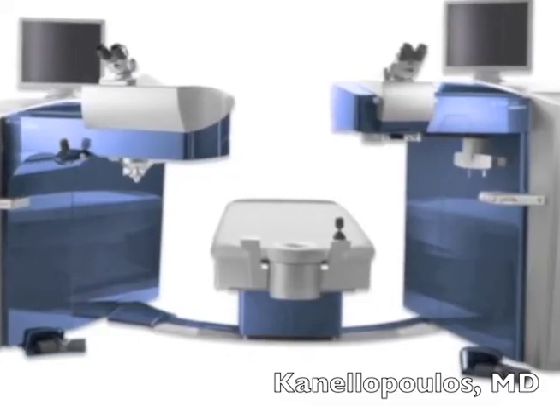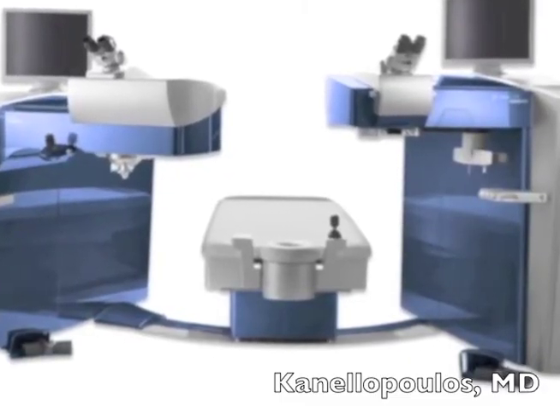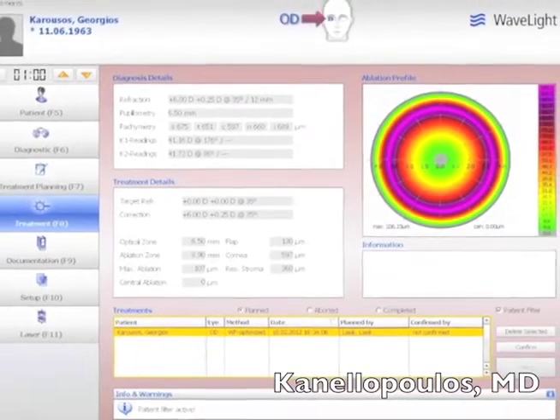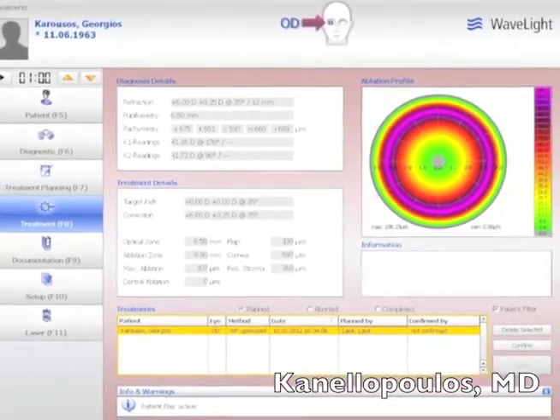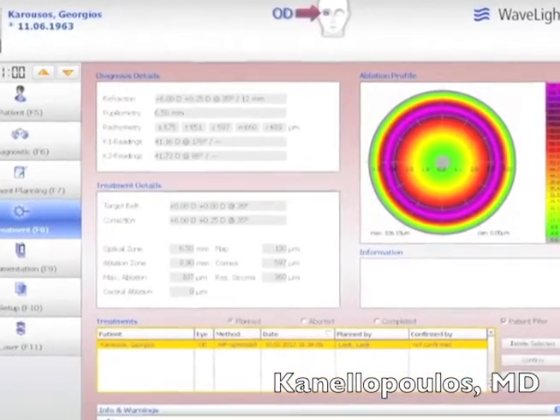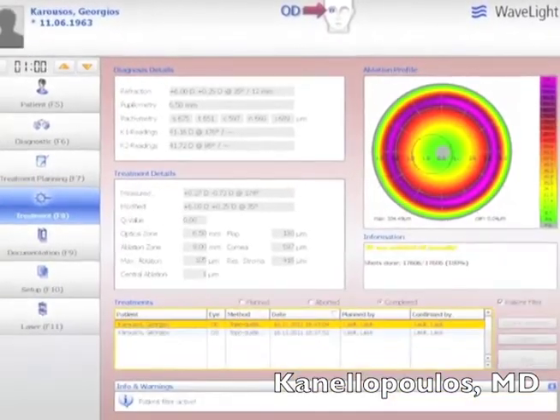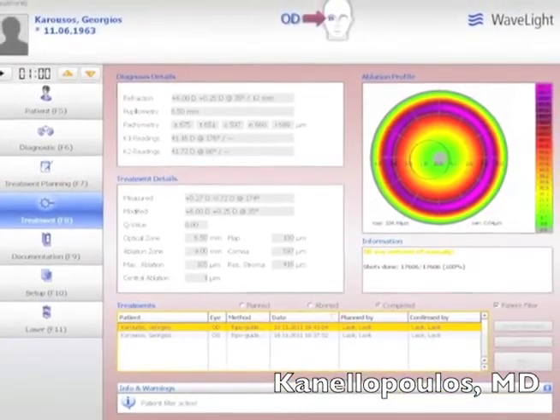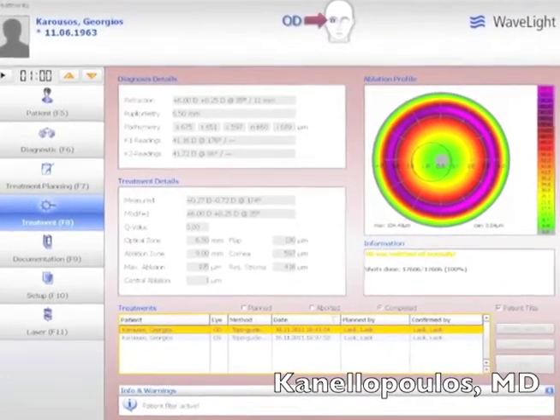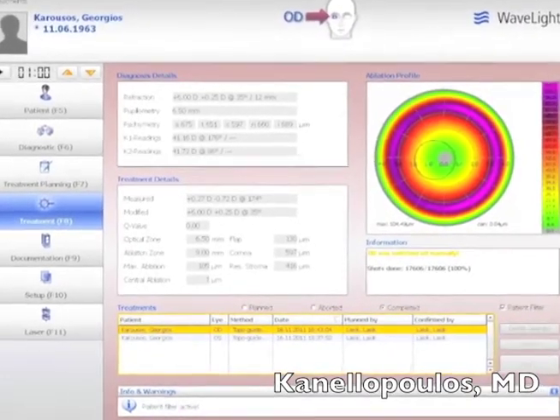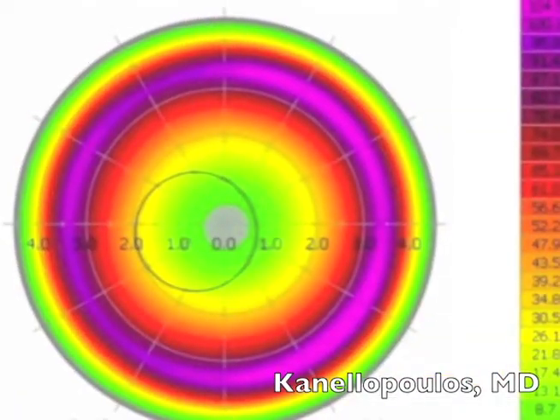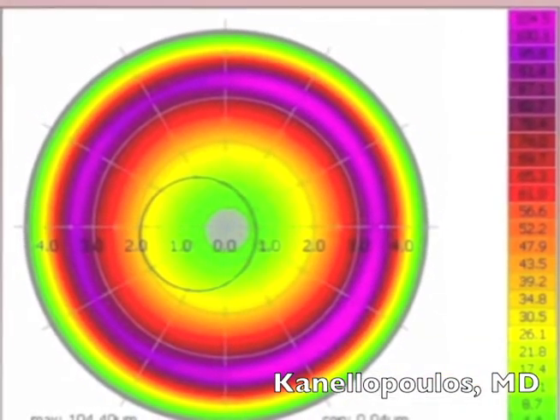We are using the Refractive Suite — the FS200 femto on the left, the EX500 on the right — and here is a standard hyperopic correction treatment plan. You can see how the pupillary aperture as captured by the topographer will be in the center, while on the right eye topography-guided you can clearly see the decentered placement of the ablation — centered on the visual axis of the patient.